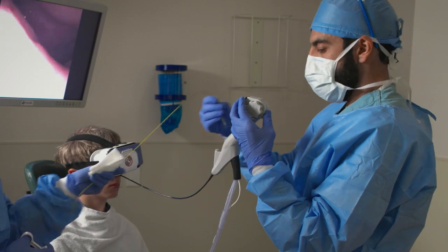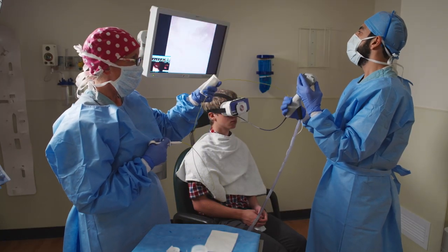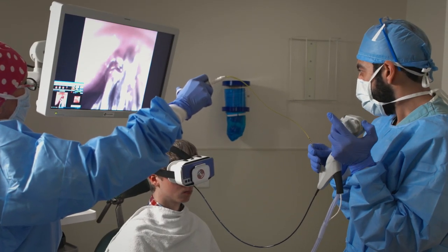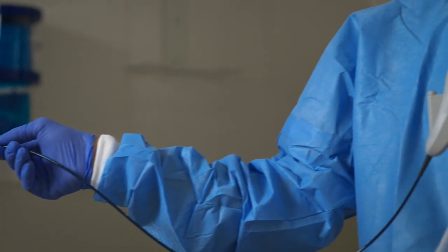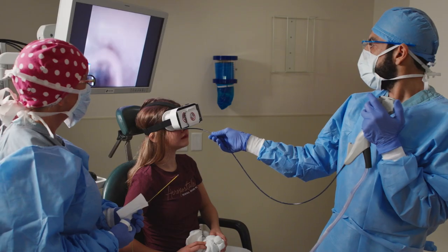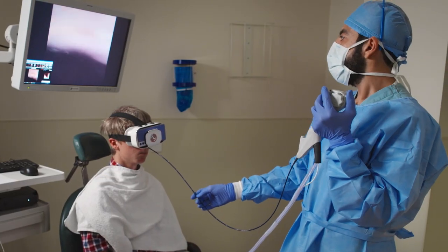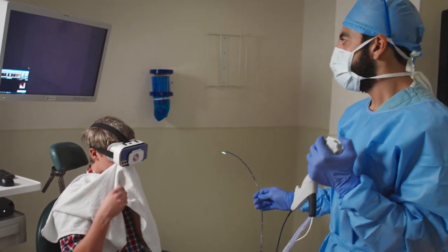During your procedure, the doctor may take samples of tissue. Don't worry, the samples are smaller than the tip of a pencil, and most people feel a gentle tug or nothing at all. Throughout this process, the doctor may ask you to swallow or put air through the scope to help them see better. If you feel like you have to burp, go ahead. Once they're done looking around, they'll remove the scope. And that's it, your procedure is complete.